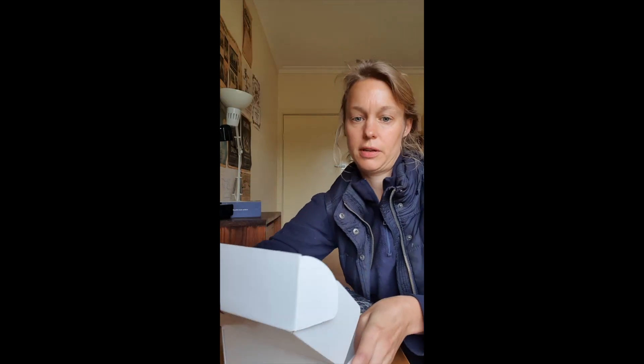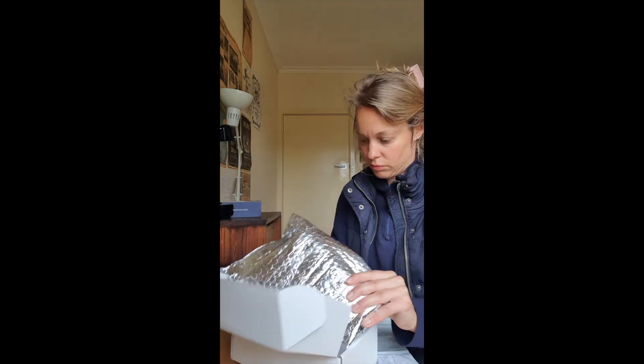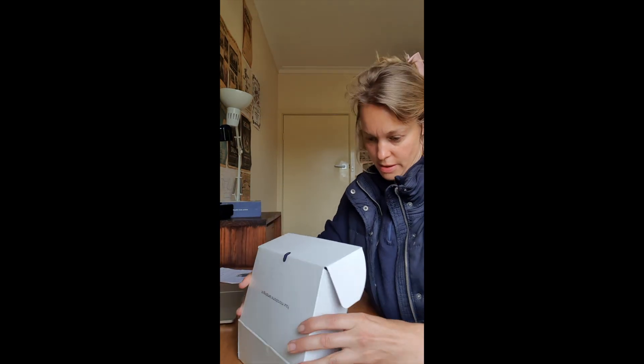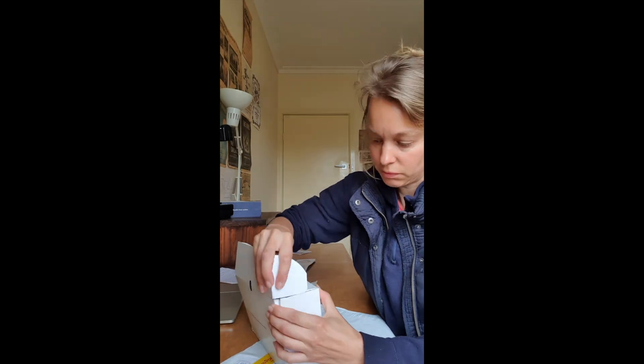Then grab the box, pop the thermal bag with the large pouch containing the two samples inside. Grab the smaller second pouch, which you haven't refrigerated, pop that on top, and then close the box as best you can. I found this a little bit tricky, but just do your best.